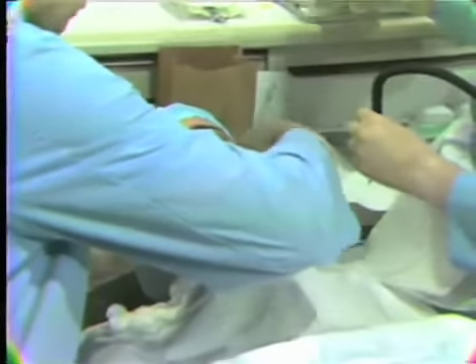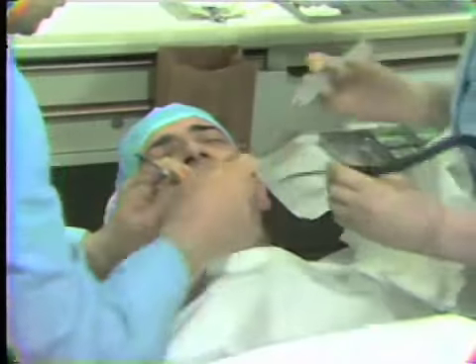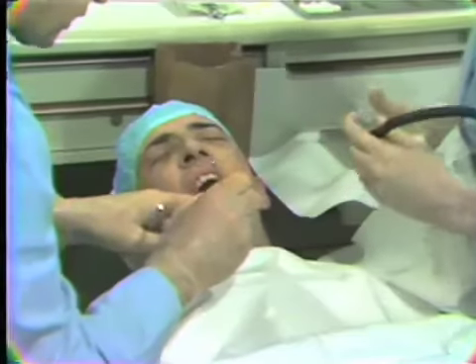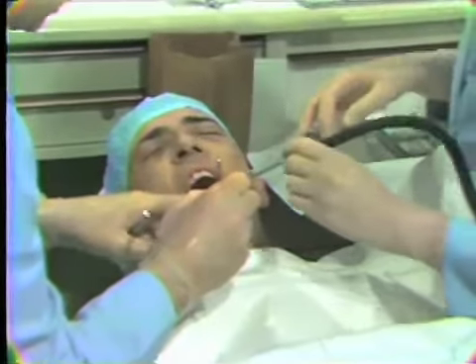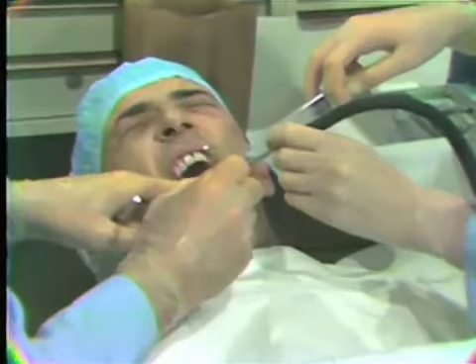Irrigation with saline solution is also helpful during the course of the procedure, again with the need that we have for clearly visualizing the roots of the teeth, for clearly visualizing the bony contour of the area.